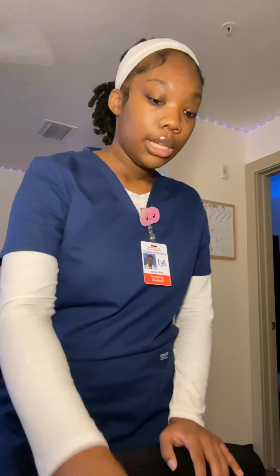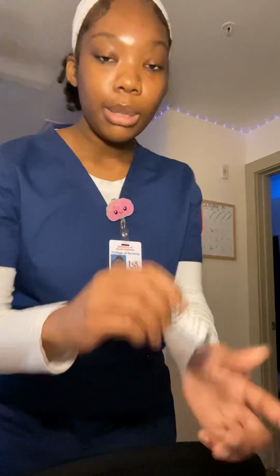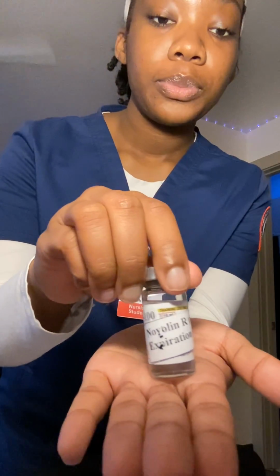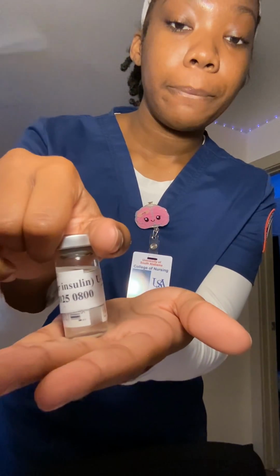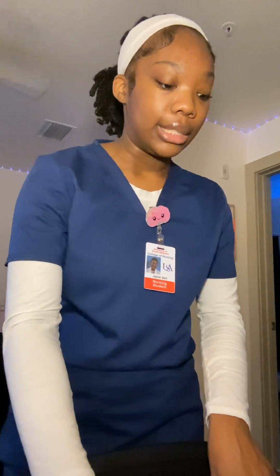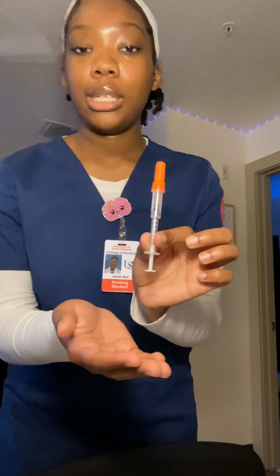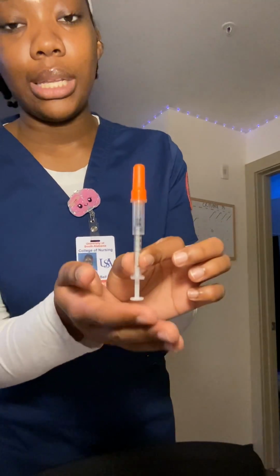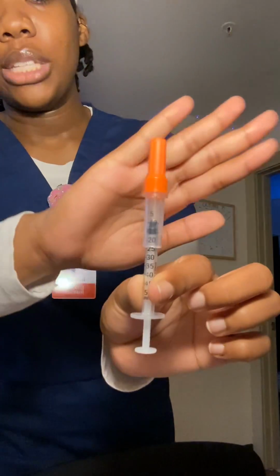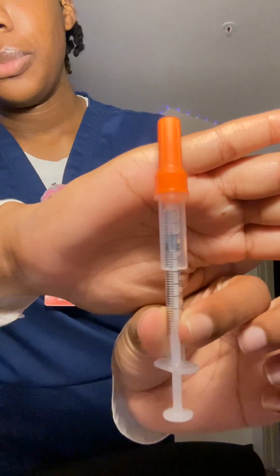For medication, it does say I'll be giving him Novolin R regular insulin. Novolin R regular insulin. Show y'all that one more time. Right medication. Okay. I'll be giving it to him subcutaneously for the right route and for the right dose, 10 units. And in this syringe, this is the correct syringe and needle to give subcutaneously. And I do have 10 units of that Novolin R regular insulin in here.